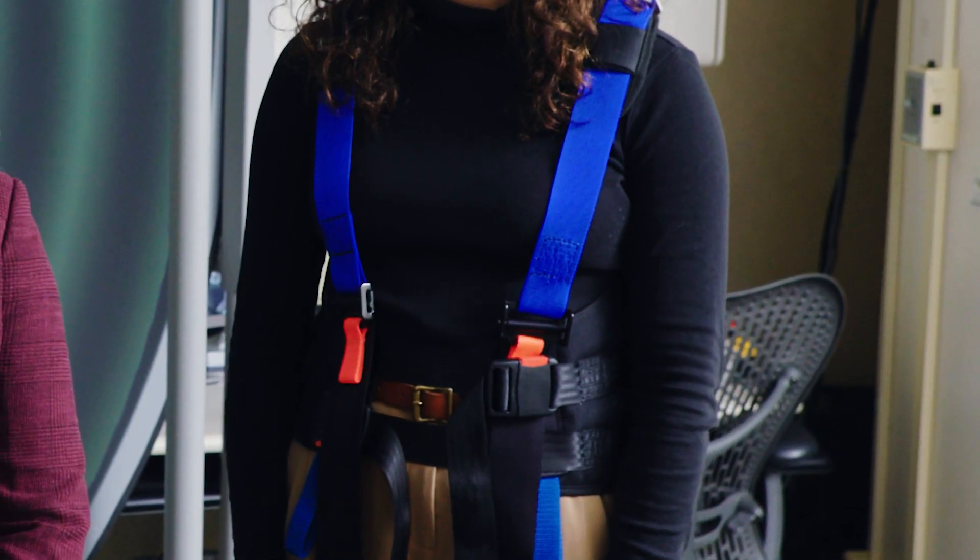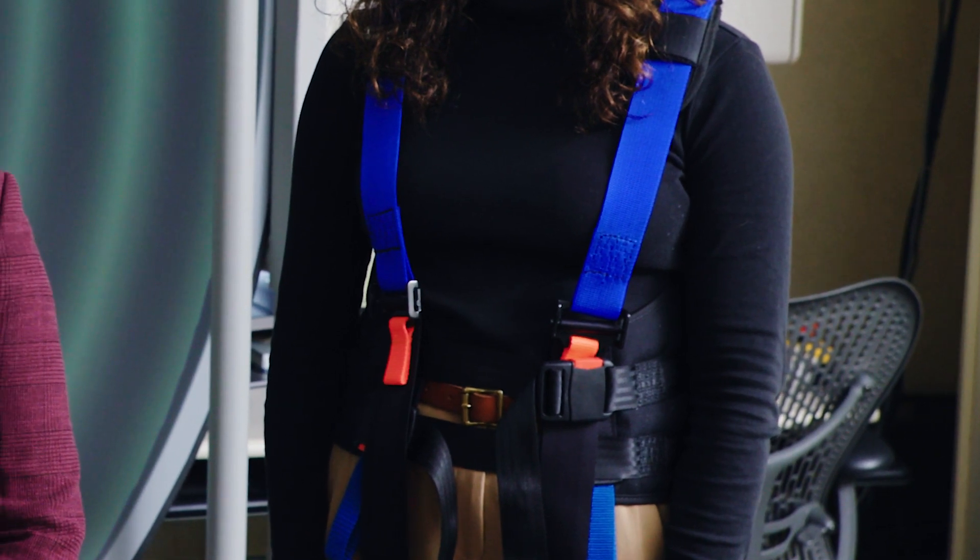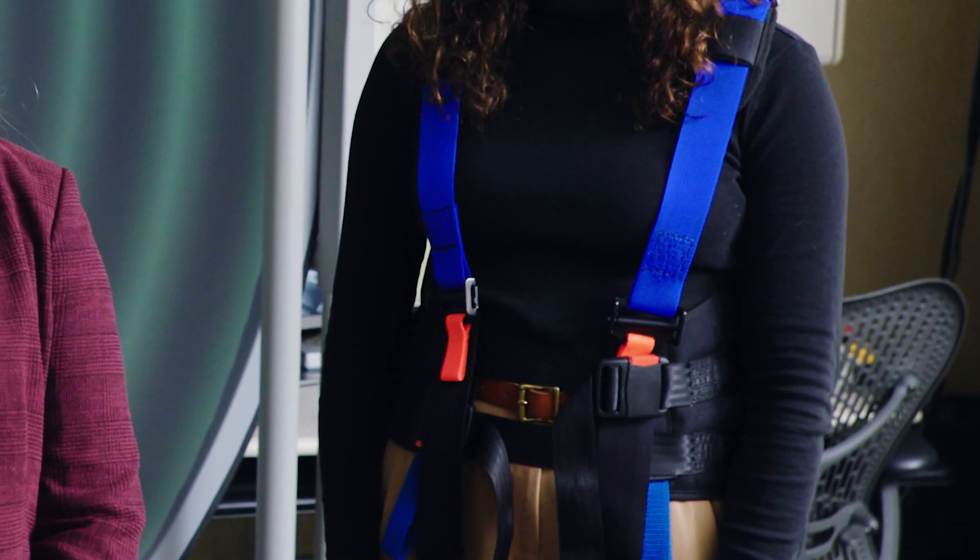What you'll want to do for this test is to maintain good balance and try to keep your balance through these various different conditions. I have my colleague Sarah here to help show what this test could look like as a patient coming in to have this test completed. All our patients come in — we have them set with a harness and attach them to our equipment in order to keep them safe. If there were any concerns about falling, the equipment will help to stabilize, and the examiner also has the ability to maintain your balance for you.